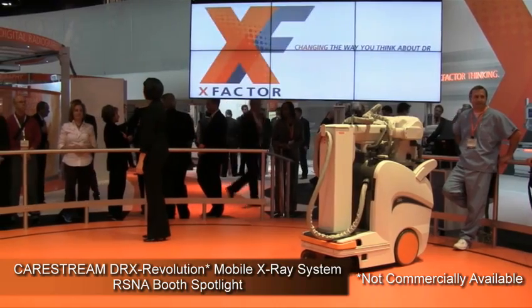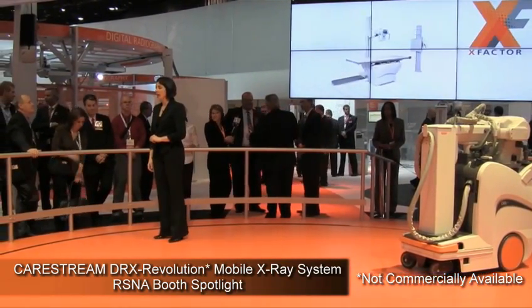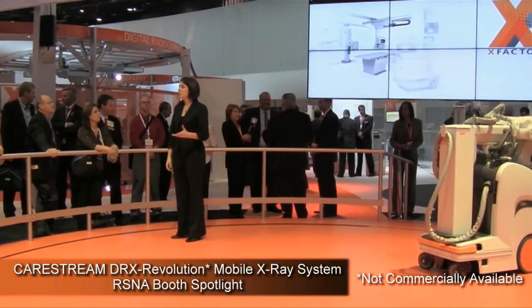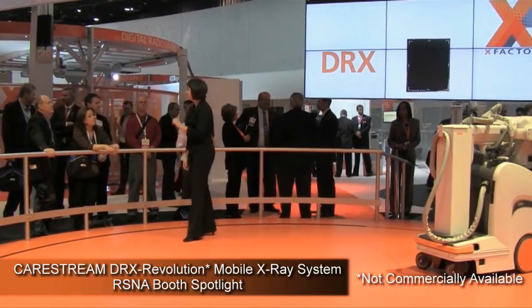X-Factor. Changing the way you think about DR. The X-Factor makes the most of your capital spending with configurable modular components powered by the world's first wireless cassette-sized DR detector.